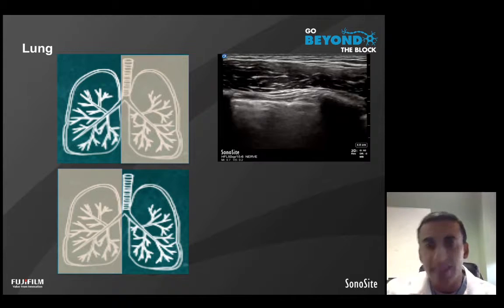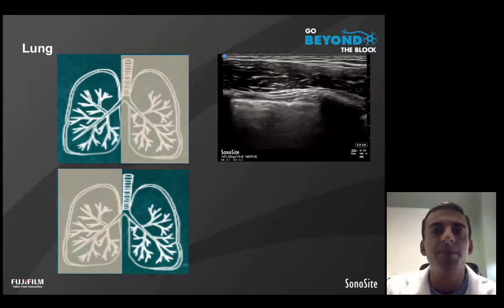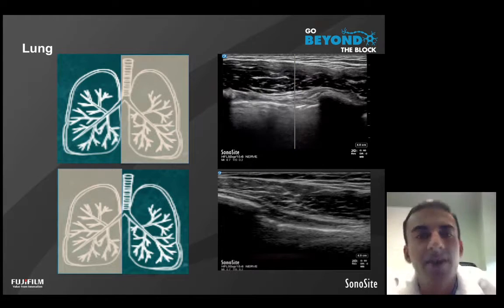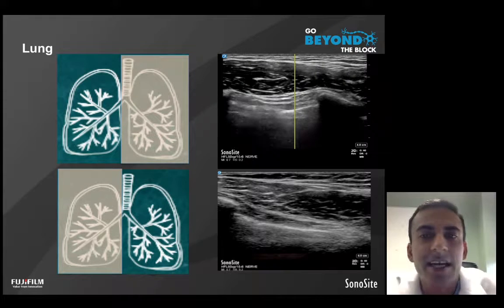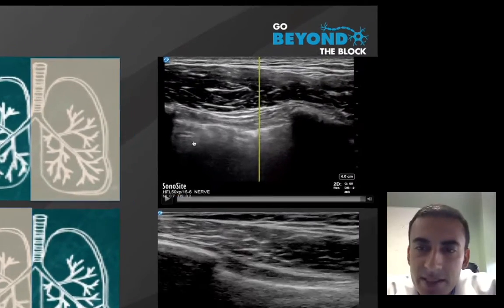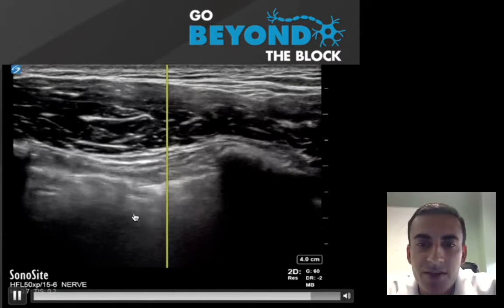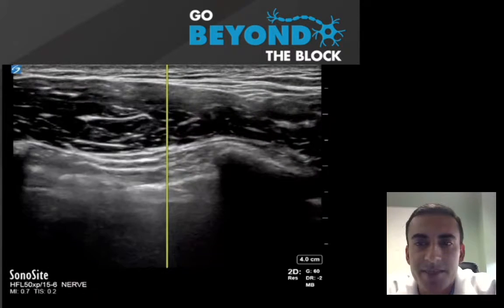However, if we add ultrasound to this picture, here's an ultrasound examination, and we'll talk about the details of this examination in future slides. But I just want to highlight again, even if you've never used ultrasound to evaluate the lung, to see if appropriate aeration is occurring, you can tell that if you focus your eyes here on the line which is the lung pleura, you'll see that there's movement indicating appropriate aeration.